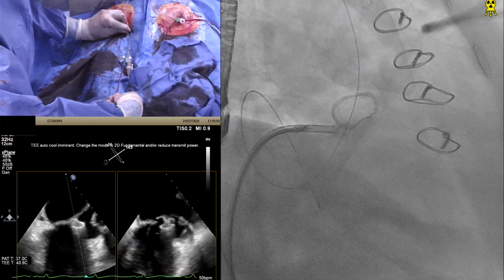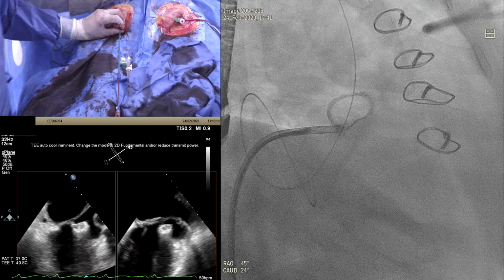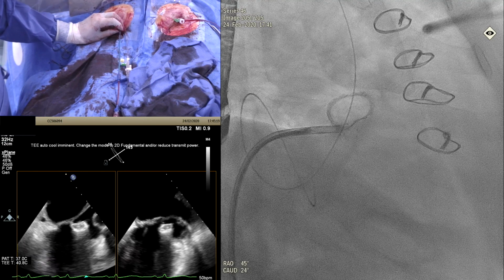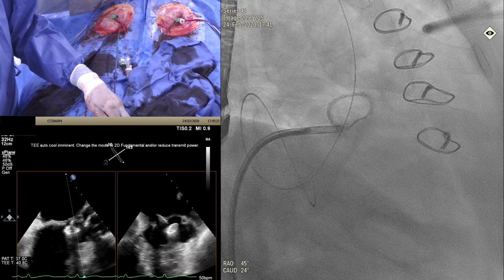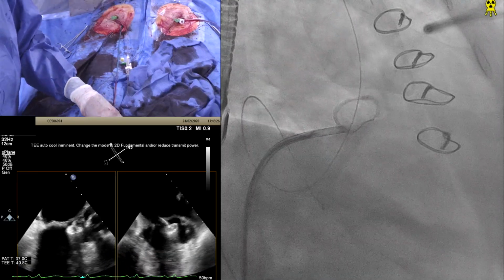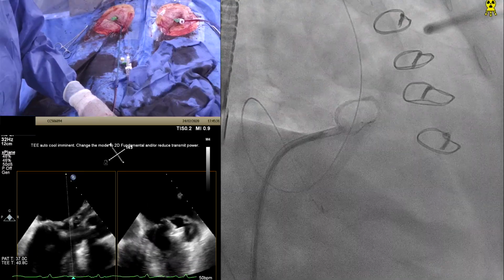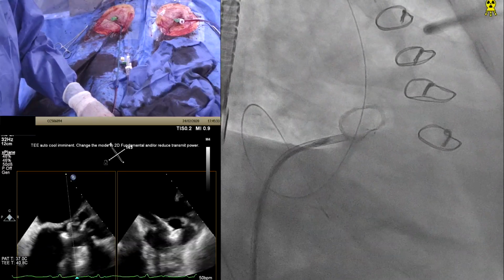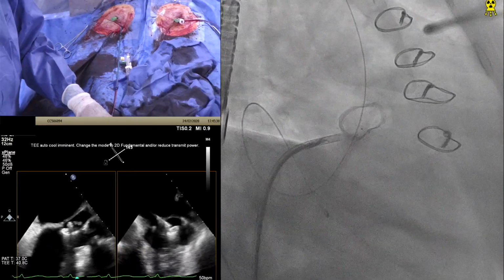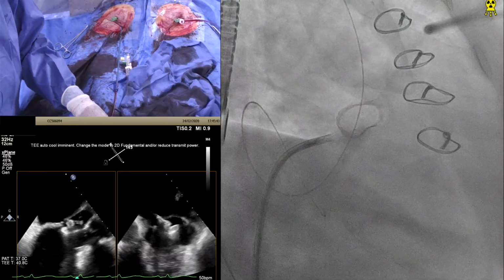Need to flick it. That's it. Okay, that's flicked over the nubbin of tissue. Okay, so I'm going to try and maintain tension with that. Yep. Okay, because that's caught on the edge. And so that's where I think I want to see if I can leave it there. And take that, that's a bit too far away. I'm pulling. Okay, I'm pulling. So hopefully I'm deploying the second disc.